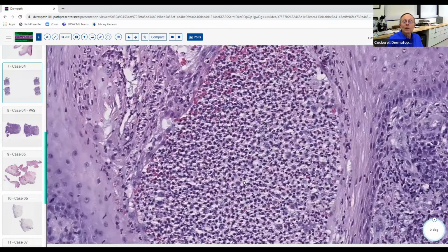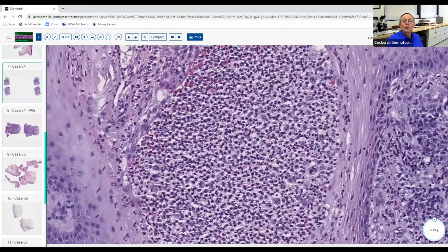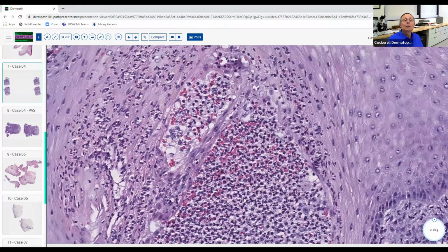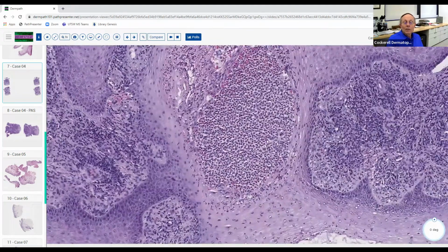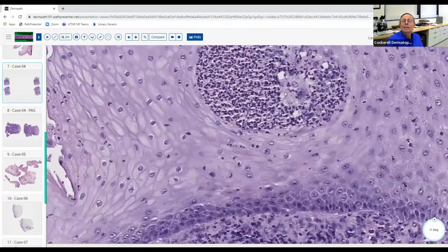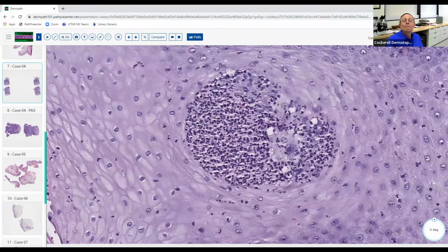So let's look in here and see if we see anything, because usually if there are neutrophils, that's acute inflammation. They say, hey, there's an organism that shouldn't be here, and they send in the polys first to try to kill it. They may not be able to do it, but there usually are some organisms left. You don't see any there. Another place to look is to see if you can find some multinucleated histiocytes. Sometimes you'll see the organisms inside the cytoplasm of the histiocyte. So you look there also.